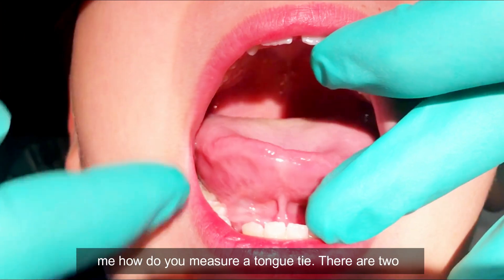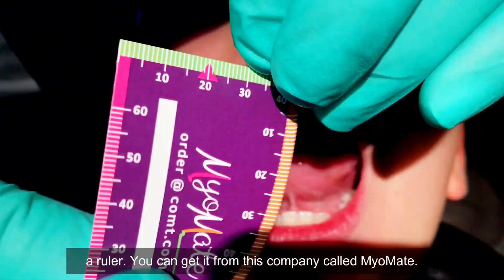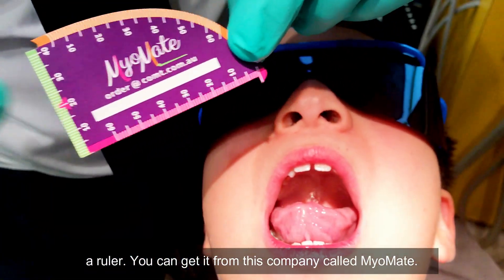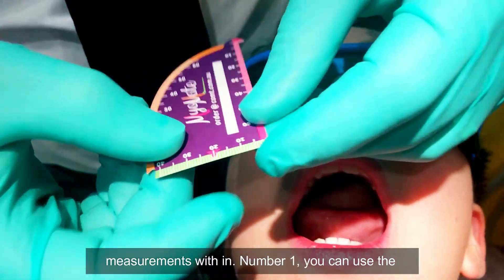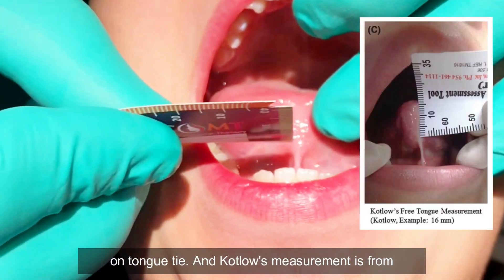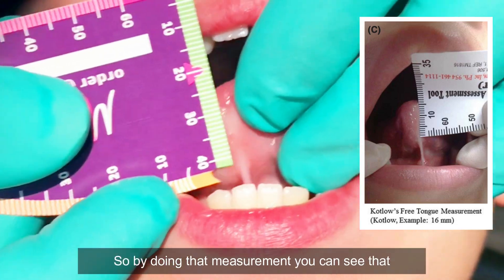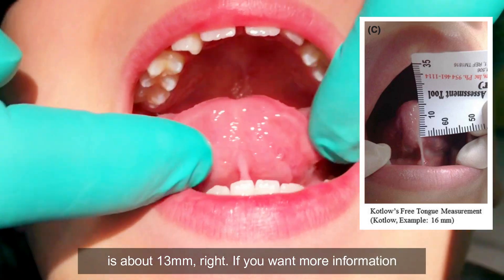People always ask me how do you measure a tongue tie. There are two ways. You can use Kotlow's measurement. This is a ruler you can get from the company MyoMate. I like this ruler because you can do a couple of measurements with it. Number one, you can use the vertical or the green to do Kotlow's measurement on tongue tie. Kotlow's measurement is from the tip of the tongue to where the frenum inserts. By doing that measurement you can see that is about 13 millimeters.